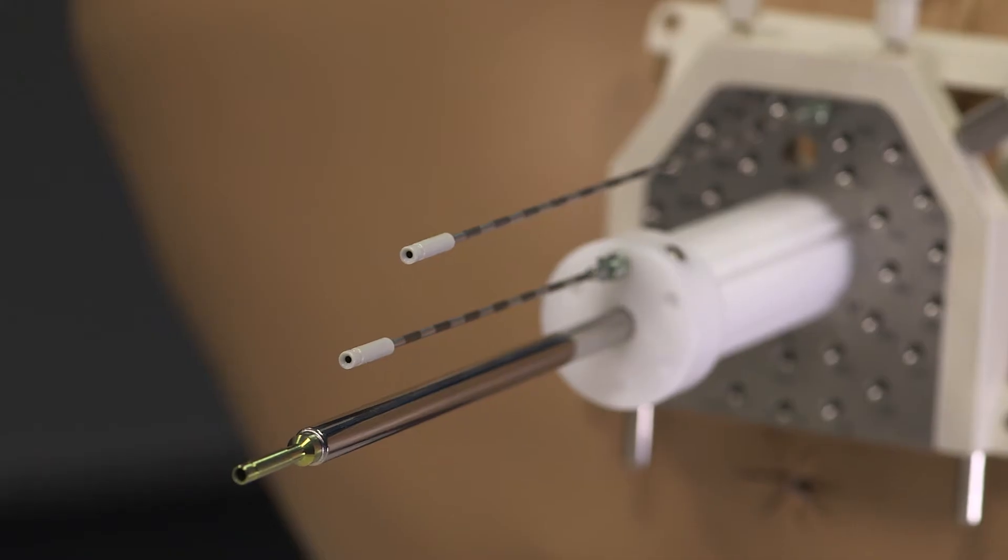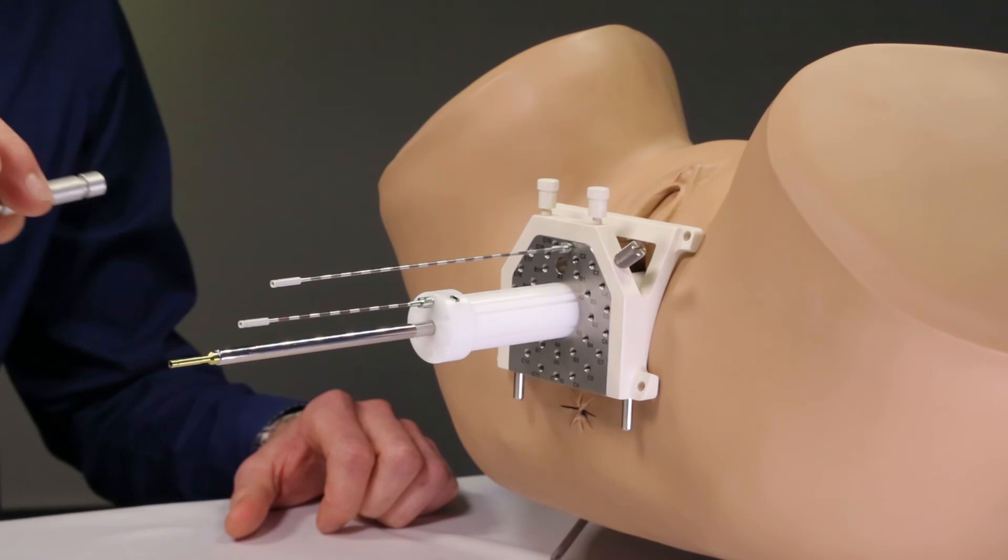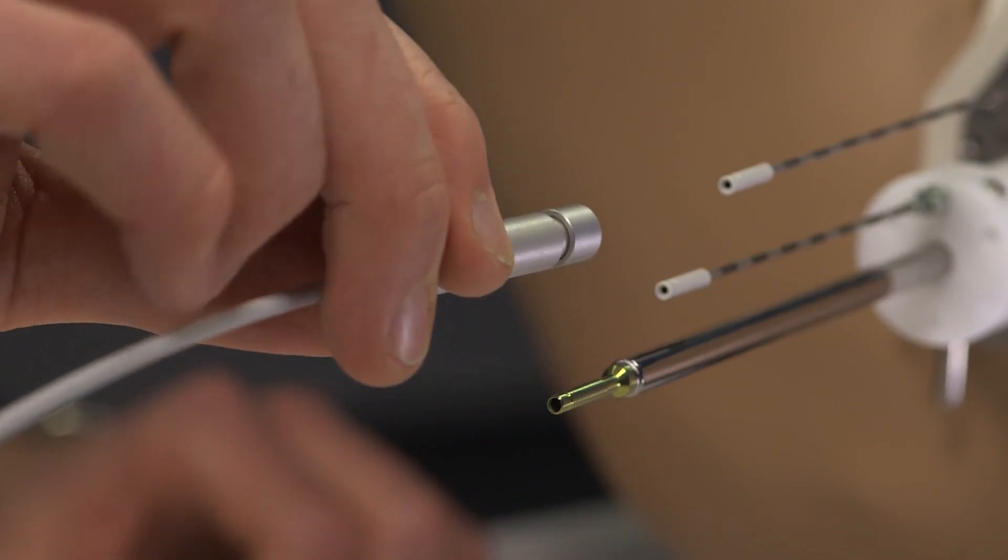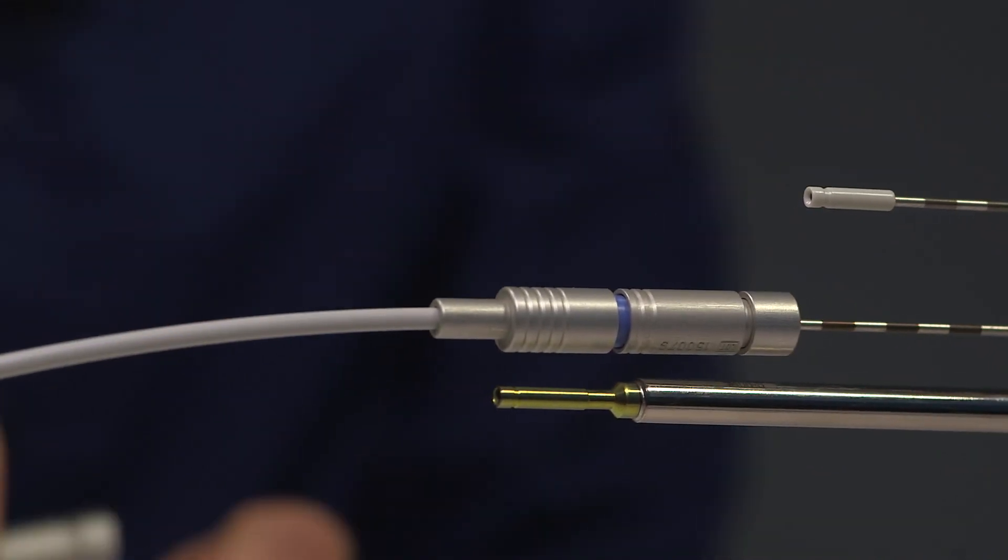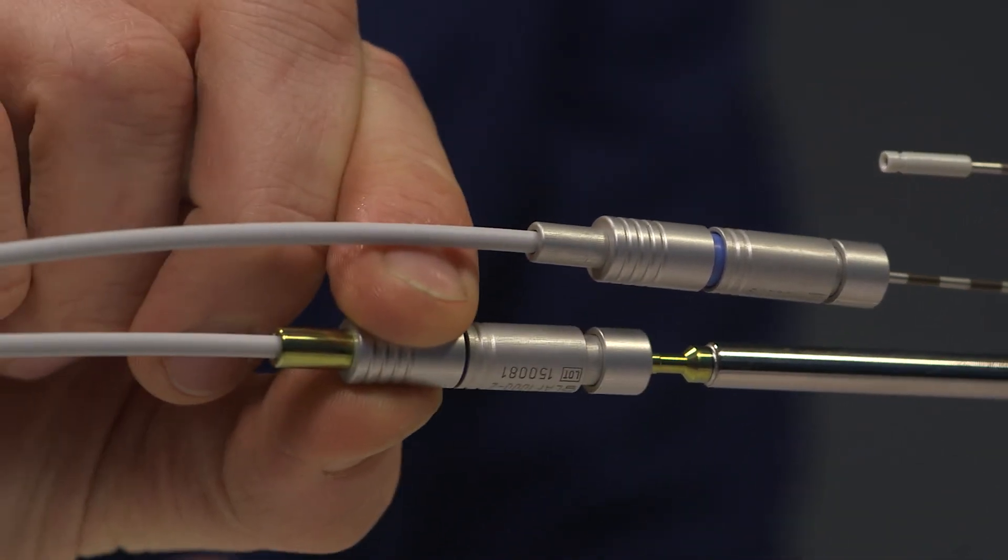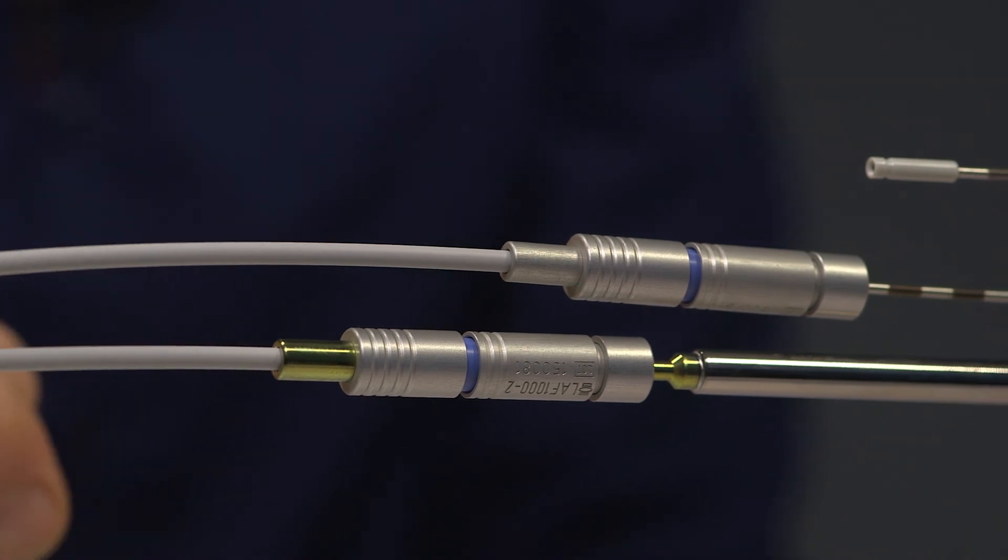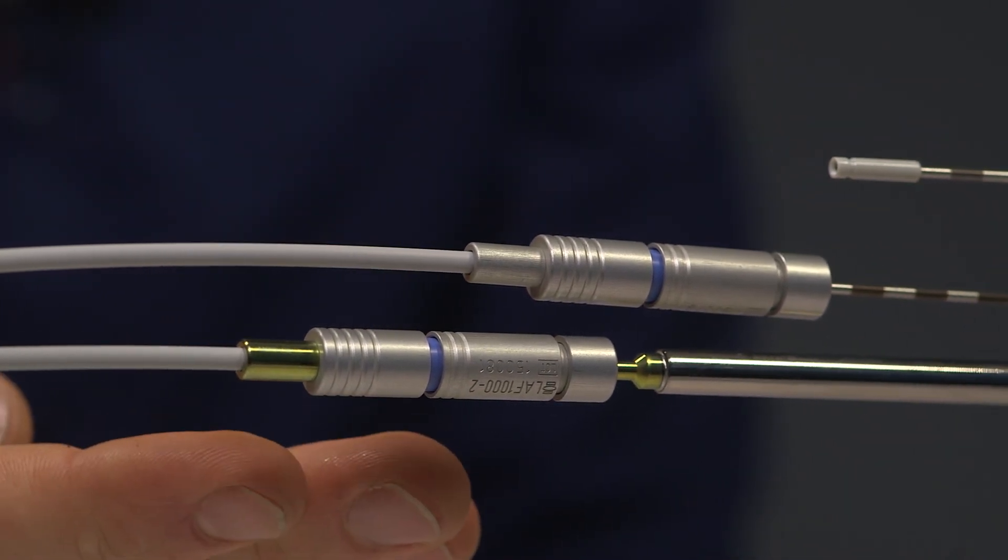In the last stage we connect the interstitial needles with the afterloader and the IU tube with the afterloader using transfer tubes. If you hear and feel a click you will know that the connection is secure.